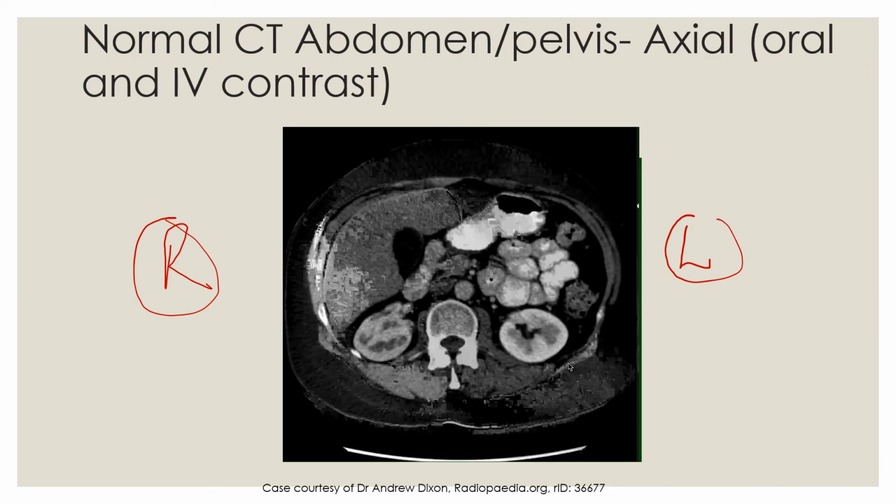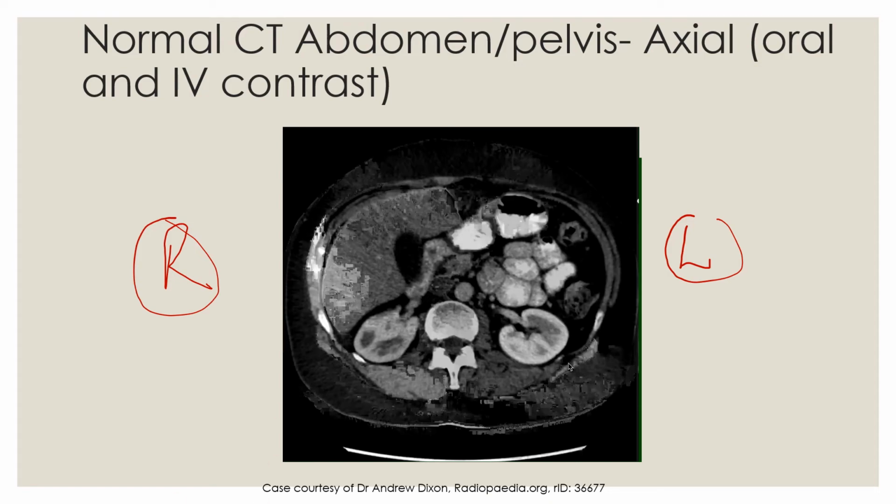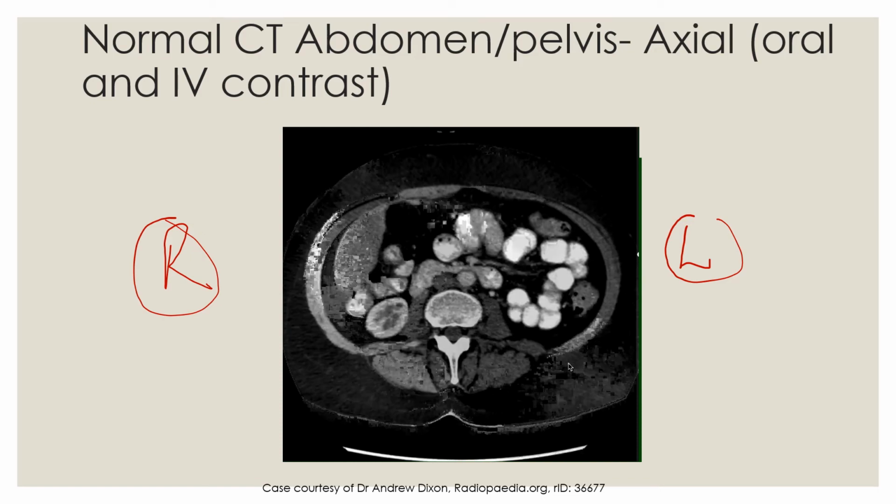So the thing that I'm looking at is our gallbladder, and it's fluid filled, and it's slightly brighter than the black fat. All of this is subcutaneous fat, which is slightly darker than soft tissue here. This is our muscle, paraspinal muscles, intra-abdominal fat, subcutaneous fat, etc.